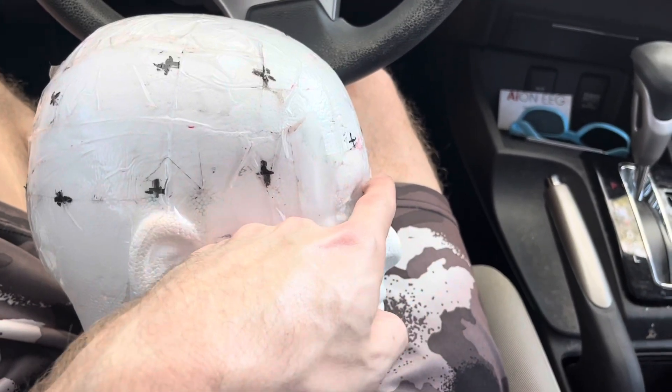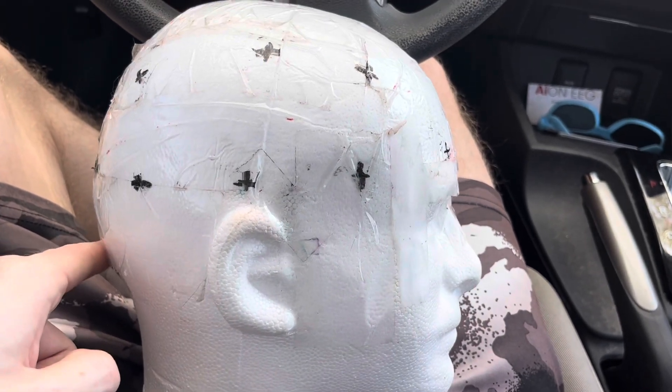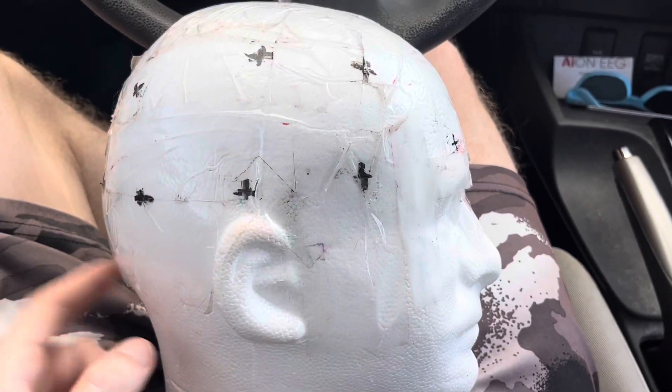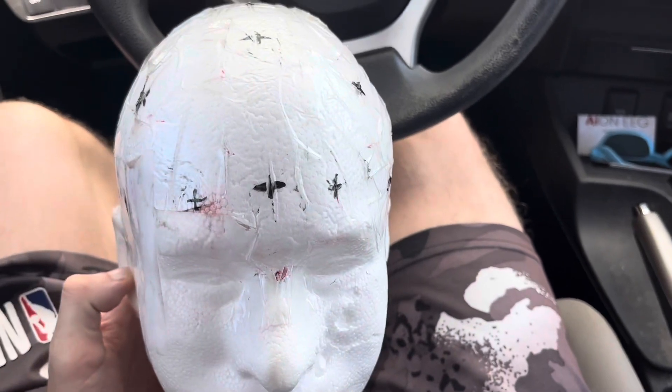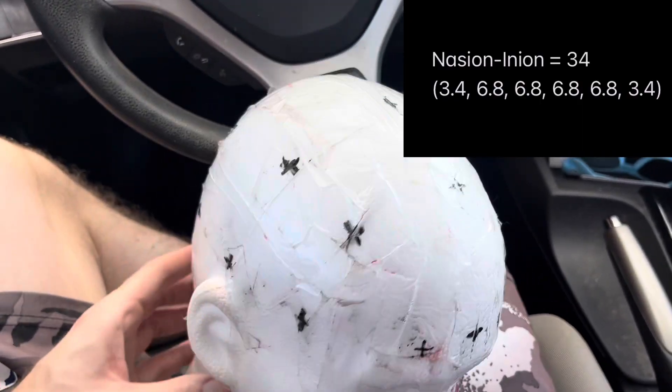The first step in measuring: you're going to go from the nasion, which is at the bridge of the nose, all the way to the inion, which is that little bump in the back of the head. Let's say we got 34 centimeters from nasion to inion — front to back.